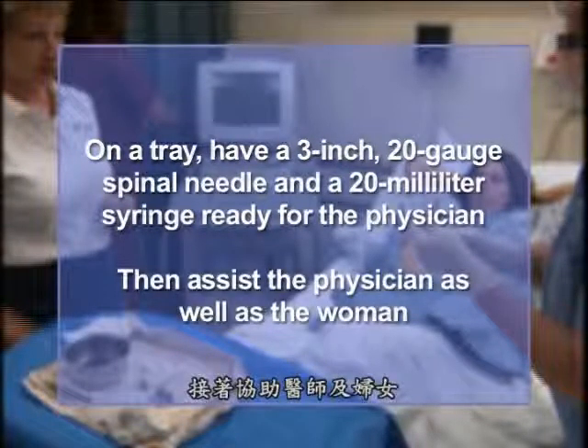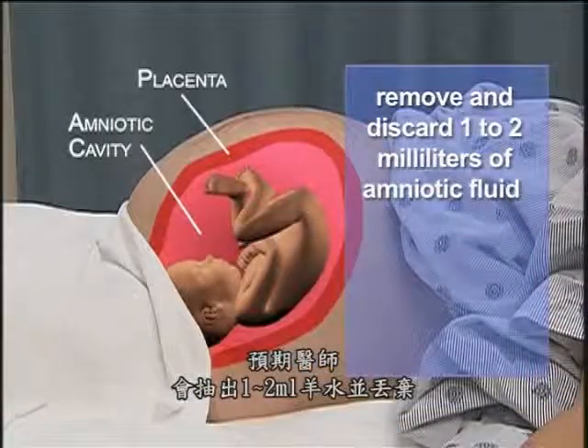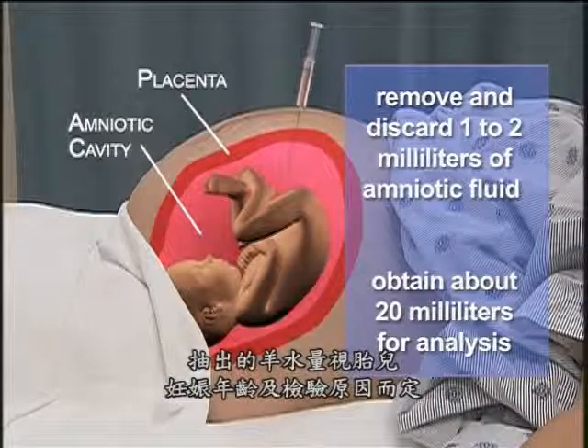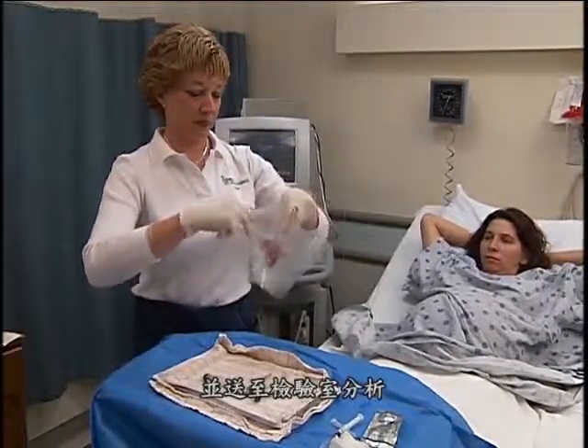Then assist the physician as well as the woman. Expect the physician to remove and discard 1-2 milliliters of amniotic fluid and then to obtain about 20 milliliters for analysis. The amount withdrawn depends on the gestational age of the fetus and the reason for testing. Then prepare the amniotic fluid sample and send it to the laboratory for analysis.